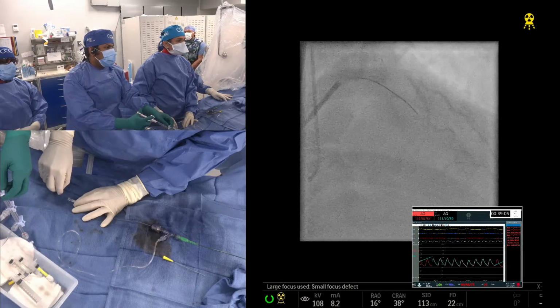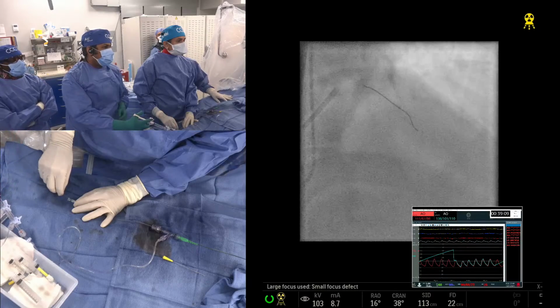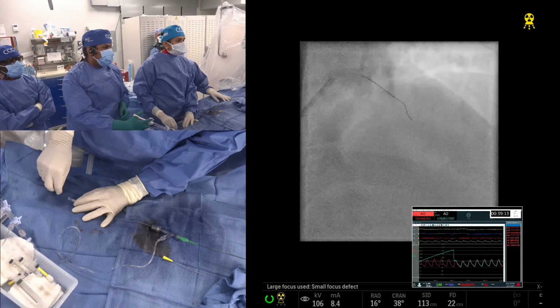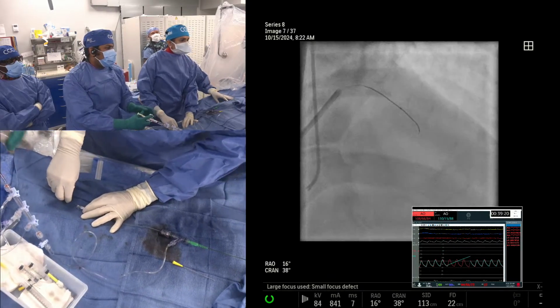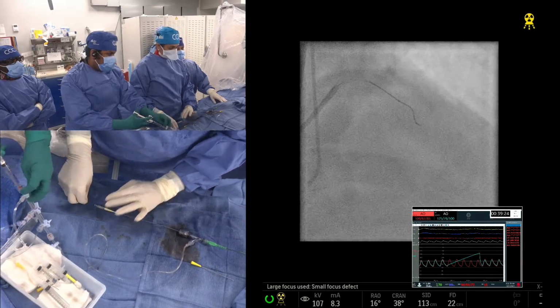Yeah, that's the septal. Actually, today we have the CTO seminar. At Mount Sinai, we have 7 CTOs. Usually we are very careful about 3 or 4 maximum, but today there happen to be by chance 7 CTOs on the schedule. This is the first one to start. Both of you will glow in the dark tonight. I already told them that I'll be here past midnight.